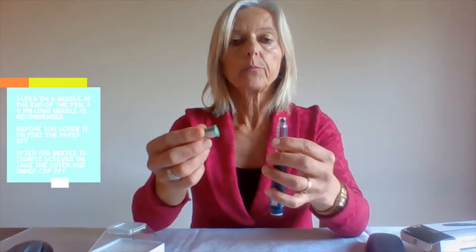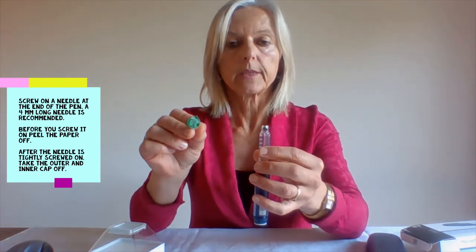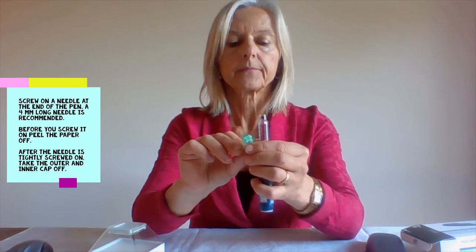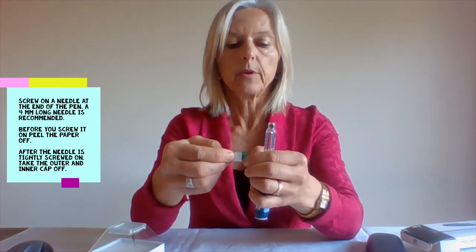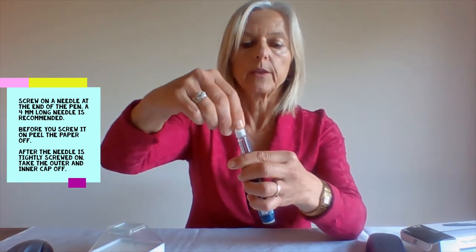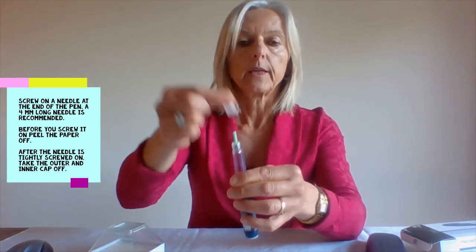You then put a needle on — this is a four millimeter needle, the smallest or shortest available. You take the paper off and screw it onto the end of the pen. Then you take the outer cap and the inner cap off.